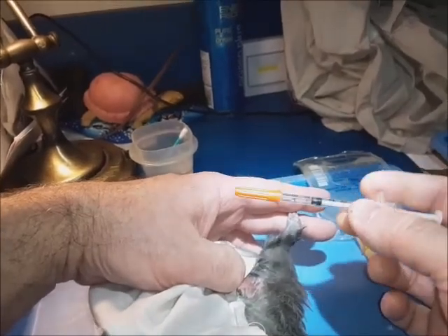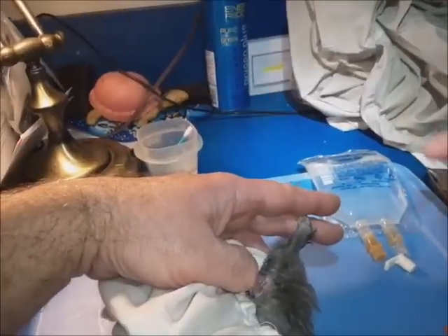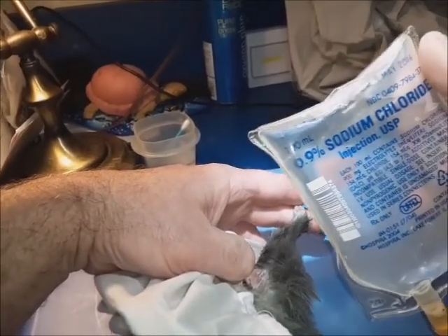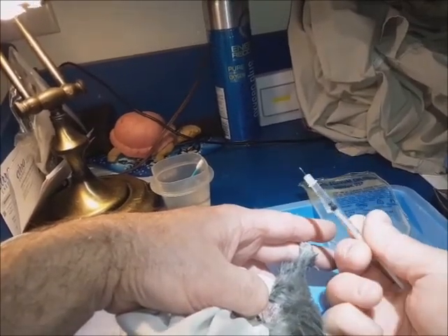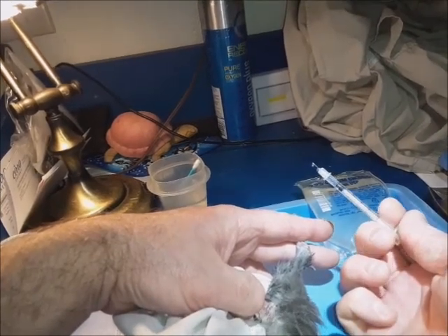I have a 30-unit syringe with just saline in it — 0.9% sodium chloride, saline for injection — because this is just a simulation. What you want to do is, of course, make sure that you push the air out of the syringe.